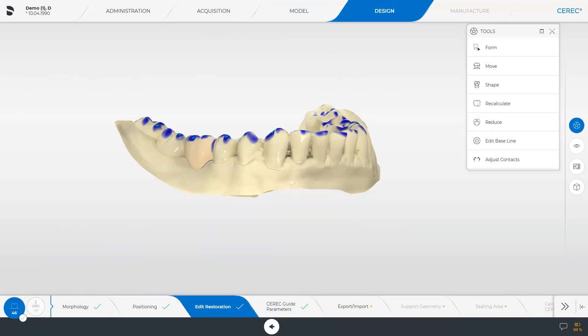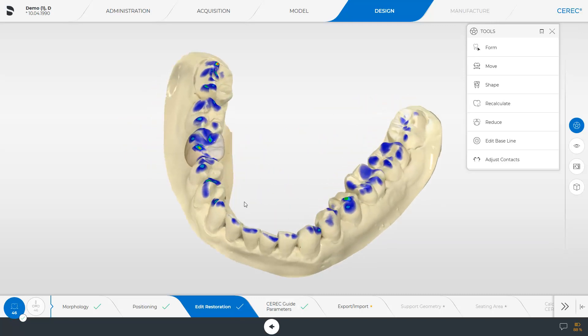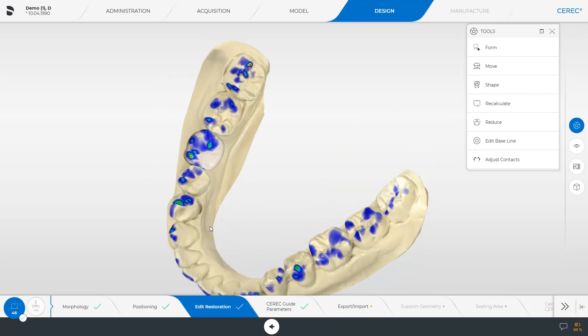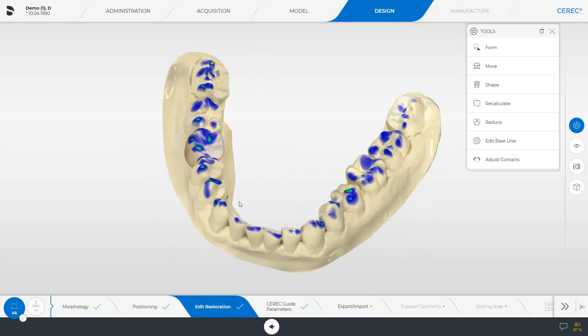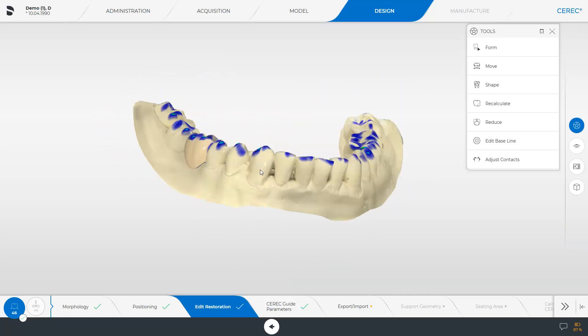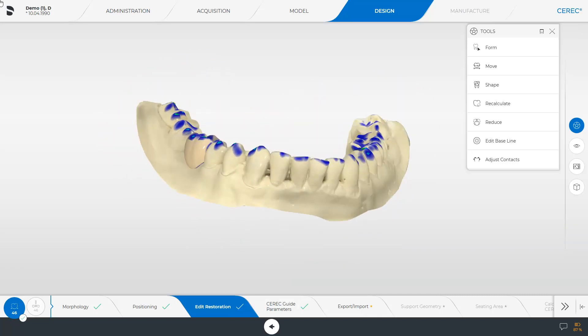The CEREC software automatically calculates an initial design proposal for the prosthetic planning, which we will first look at from all sides. If necessary, the suggestion can be revised using the tool palette. The prosthetic planning is transferred to the CECUT implant software with the export data and is used for optimal planning of the implant position in relation to the prosthetics.